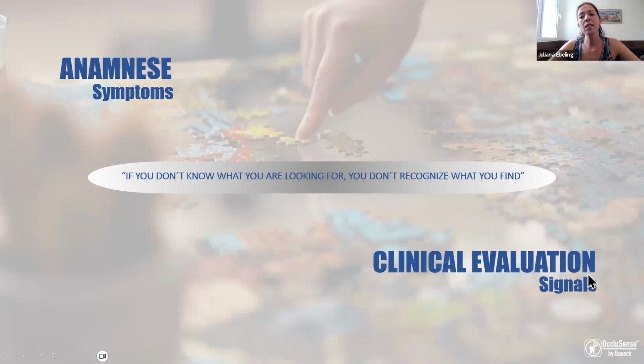We can check the result of these symptoms in the clinical evaluation with the signs. This is really, really important before starting the clinical evaluation with any device. Because if I don't know what I'm looking for, I will not recognize what I will find. This is the maxim that fits very well to this situation.